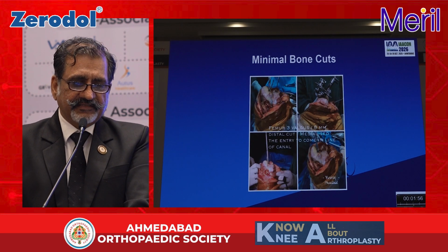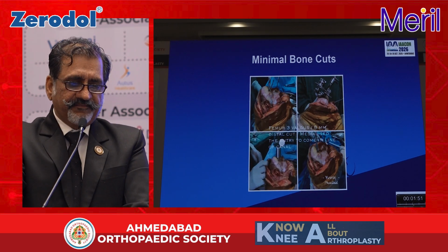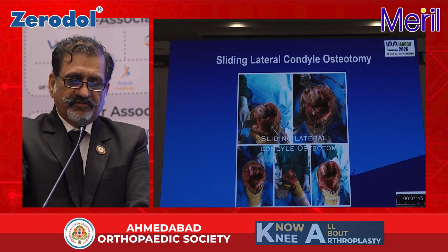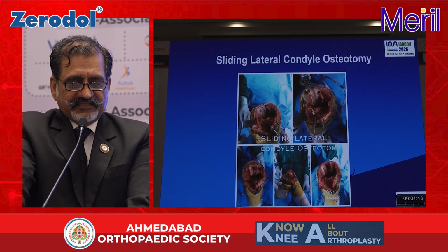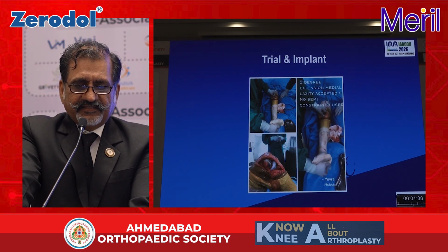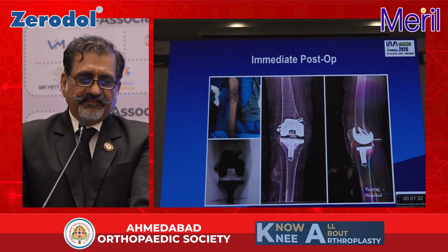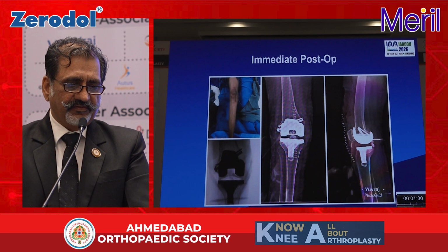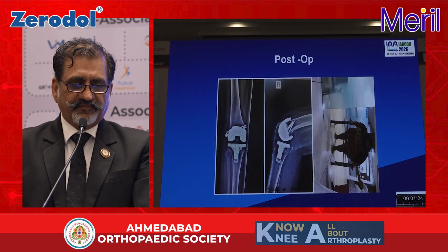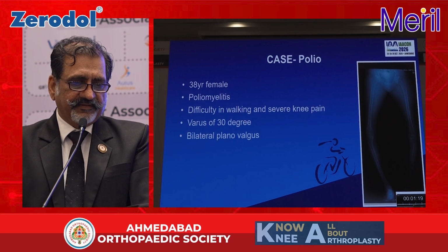So minimal bony cuts, and medialize the entry to match the femoral canal. In this case, we ended up with a sliding lateral condylar osteotomy to match the flexion and extension gap, and that's our trial. In this case, we accepted a little laxity in extension as well. That's the immediate post-op AP and lateral view. That's the clinical picture of the patient.